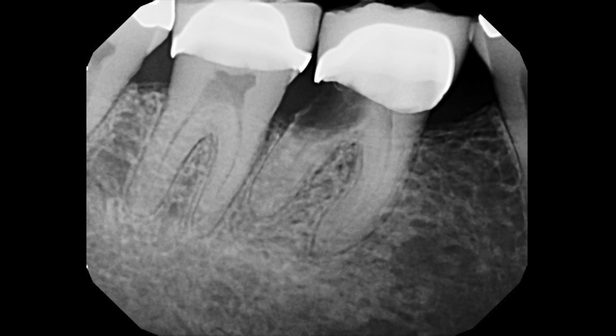The second premolar was taken out and the teeth moved forward orthodontically many years ago, and as you can see, the tooth does have that tilt to it. Now if I go down and try to section like I normally do, meaning drop the burr kind of parallel to the normal alignment of all the other teeth, you can see the problem.